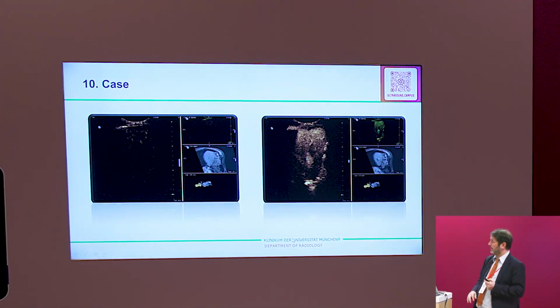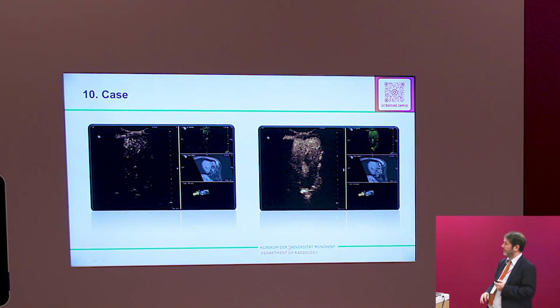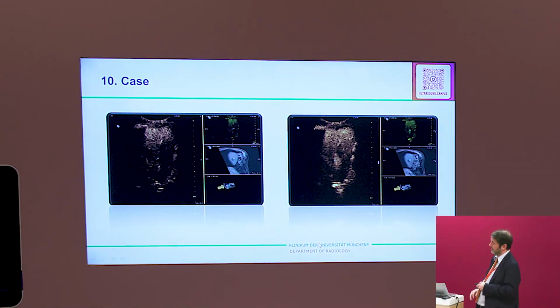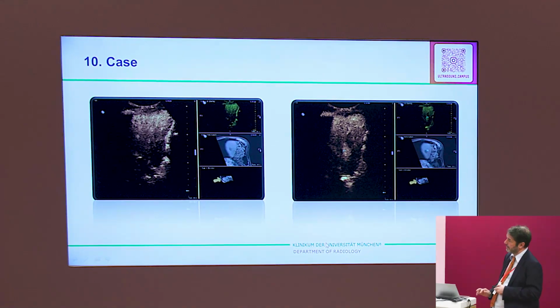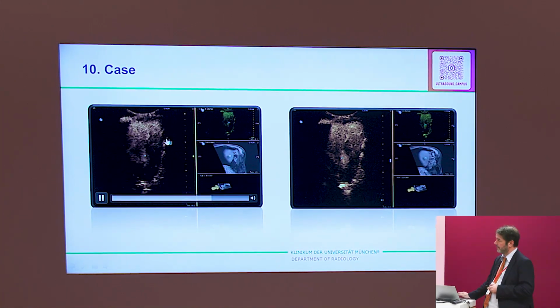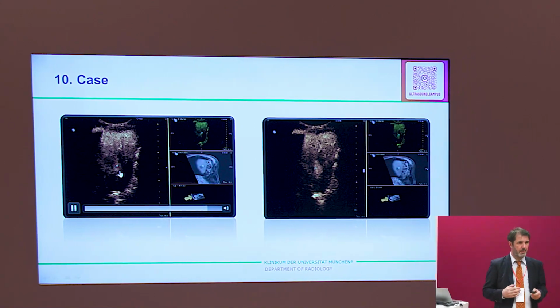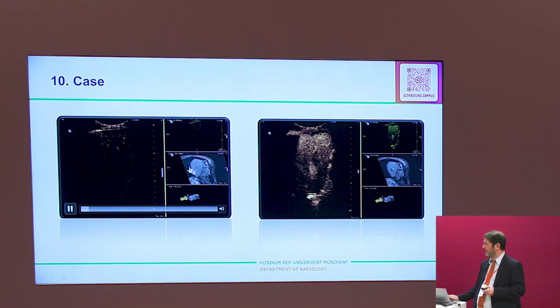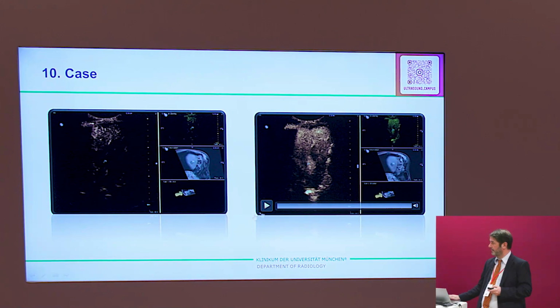So we inject contrast. Takes a little bit. There's a marker. And now you see this lesion is filled with contrast. You see? There. It takes quite a long time, or? And if you look later, still filled with contrast.